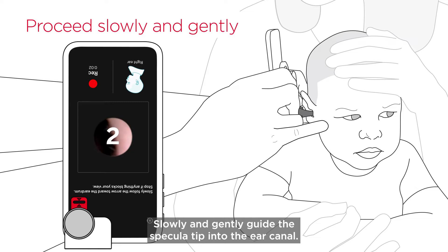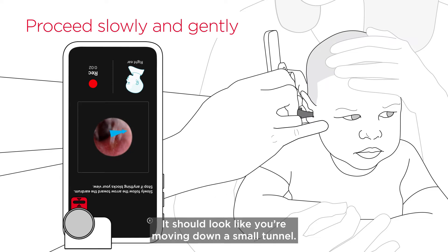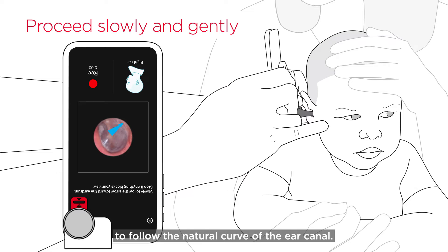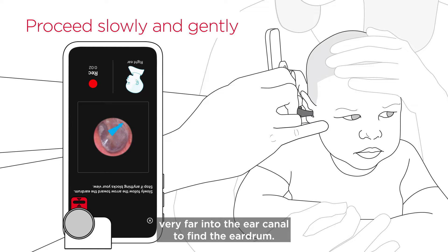Slowly and gently guide the specula tip into the ear canal. It should look like you're moving down a small tunnel. You'll need to angle the specula tip slightly towards your baby's nose to follow the natural curve of the ear canal. Keep in mind that you should not have to insert the specula tip very far into the ear canal to find the eardrum.